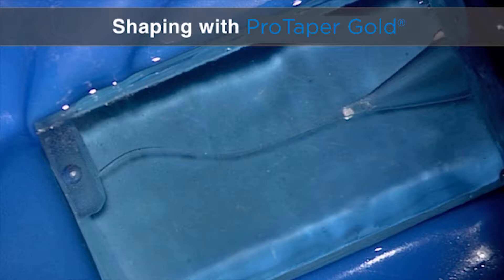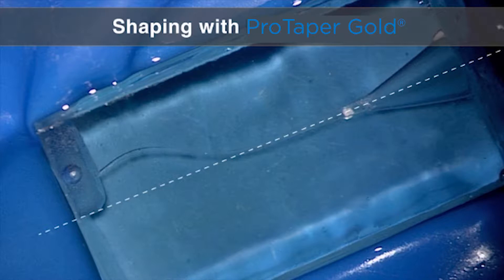Plastic is harder than dentin to work in. Because it's a little softer than the Brunel hardness of dentin, it's much easier to ledge or block a canal. So we're going to have to put all the steps together very precisely and follow them exactly as we talked about earlier so that we can guide this canal shaping procedure right to a successful conclusion. Let's take a closer look at what the challenge is.